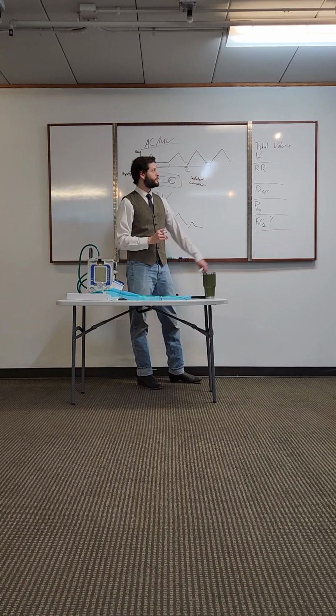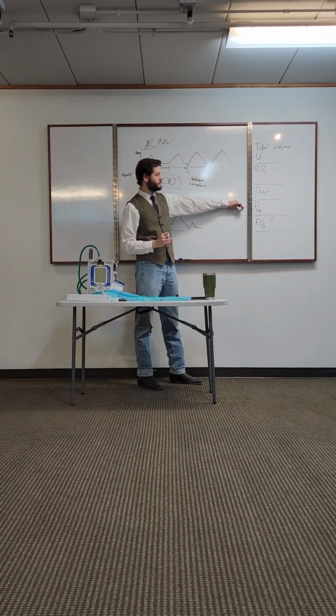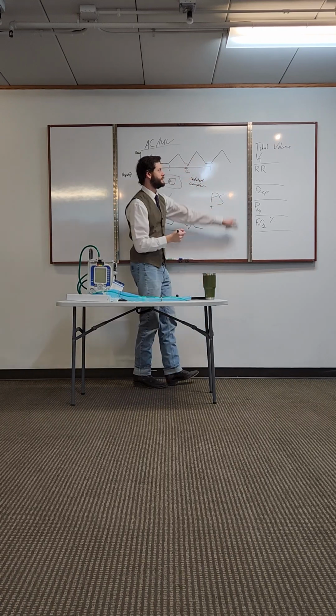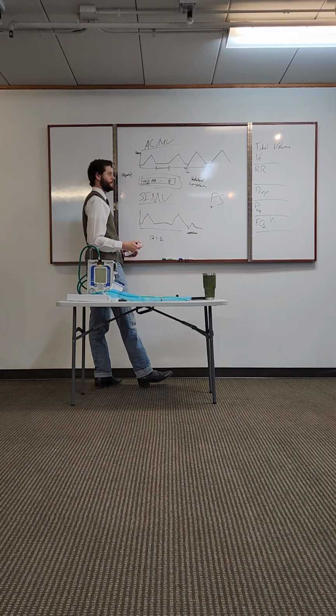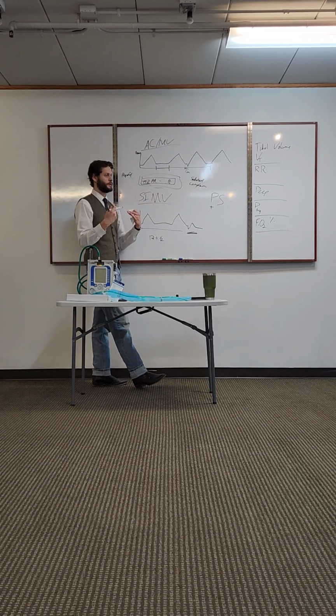The only difference is that this is going to be ACMV and SIMV. The one addition that you can get with SIMV is the pressure support in addition to these. So when a patient takes their breath, they can do it with a BiPAP type of method, as they can have additional inspiratory pressure to help that breath.